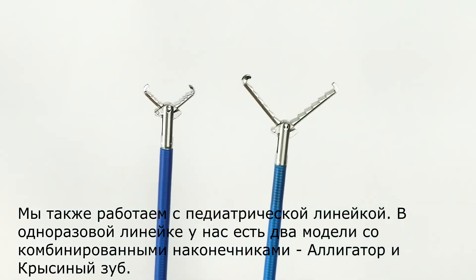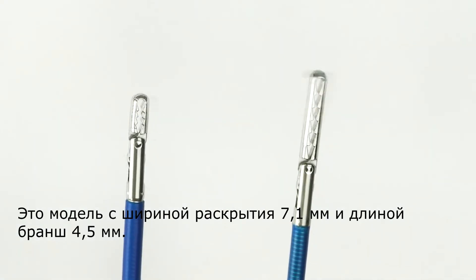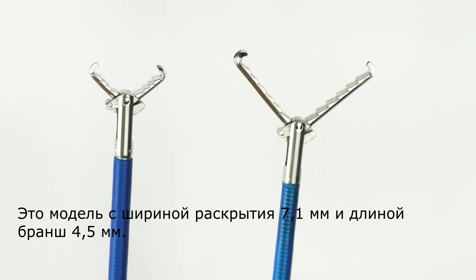In the disposable line we have two mixed tip models: alligator and rat tooth. This is the 7.1mm opening model with a 4.5mm length.